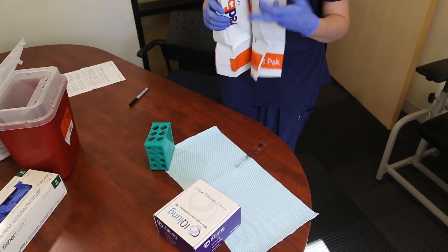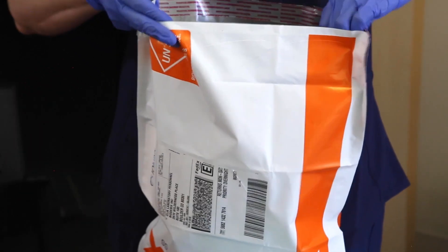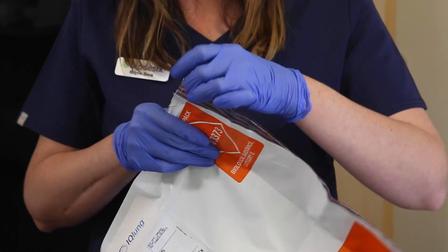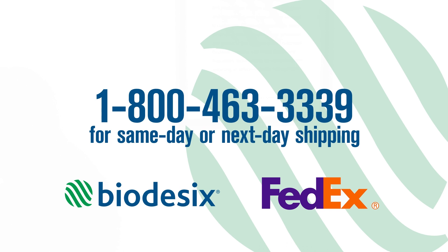Lastly, prepare the kit for shipping to the biodesics laboratory in Boulder, Colorado. Place the kit into the provided FedEx clinical pack. Seal the pack and deliver the specimen at room temperature. Contact FedEx at 1-800-463-3339 for same day or next day shipping, or place the clinical pack into a FedEx drop box shortly before pickup time. Shipments are accepted Monday through Saturday. Please avoid leaving specimens in a drop box overnight.